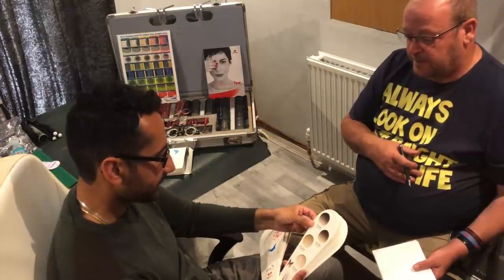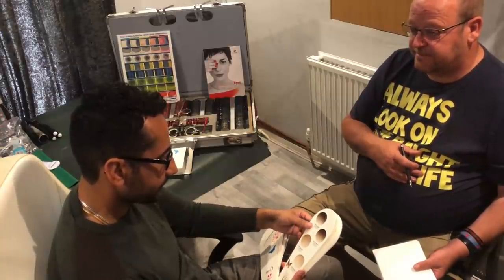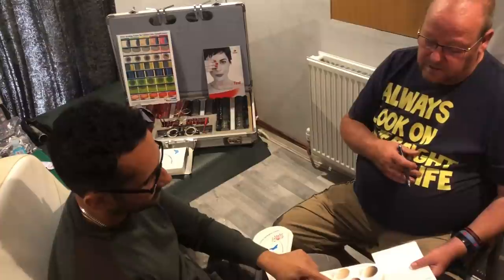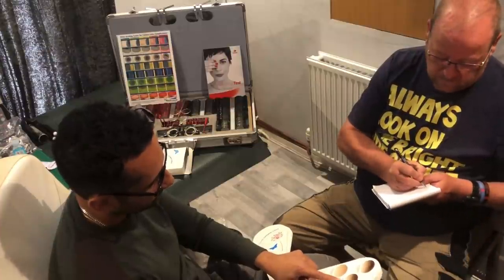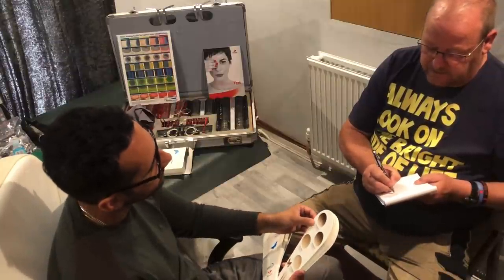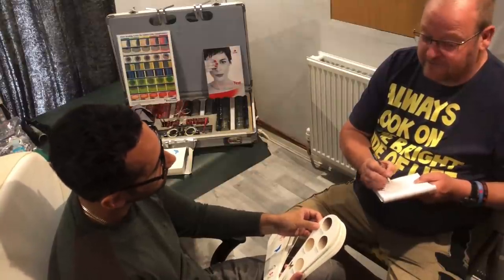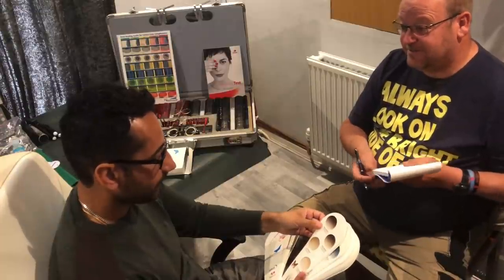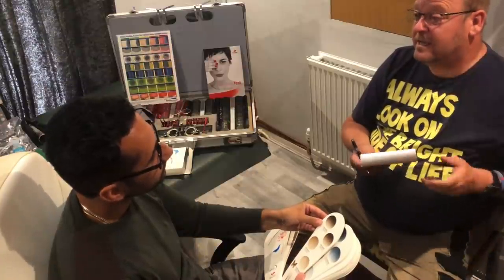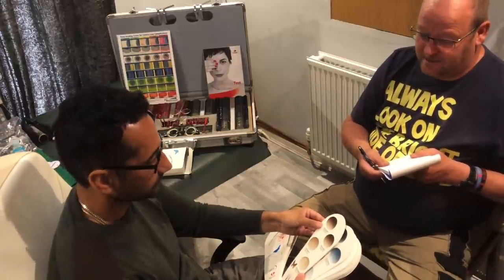I think this is great. And you can buy some sunglasses with graduated tints. I think if I get a pair for holiday, I'd like the 75% absorption. Then when I go into my villa, I can read the Financial Times while I'm eating my lobster. The advantage of having them for holiday — it's amazing how many people walk into a shop on holiday and forget they've got their sunglasses on and then they can't see anything.